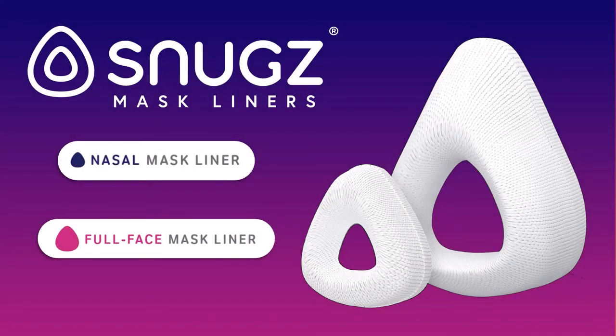Introducing Snugs — machine washable liners designed for either full face or nasal CPAP masks. They help reduce noisy leaks, prevent redness and irritation, and feel great against your skin.